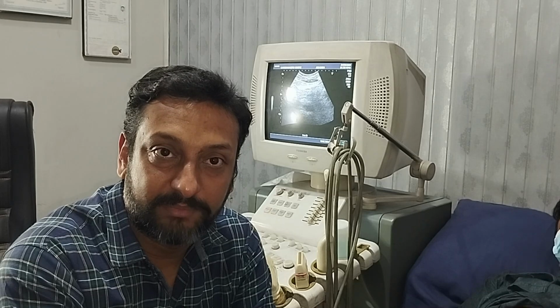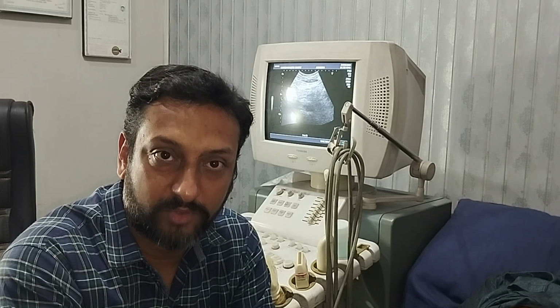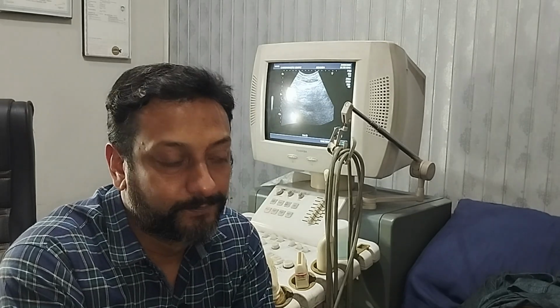In this episode, we are going to cover a relatively difficult organ to be visualized on abdominal ultrasound, and that organ is the pancreas. I personally consider the pancreas one of the toughest organs to be visualized on abdominal ultrasound, because the abdominal gases, the gut and the stomach are obscuring the pancreas most of the time. For this purpose, I give you a tip.